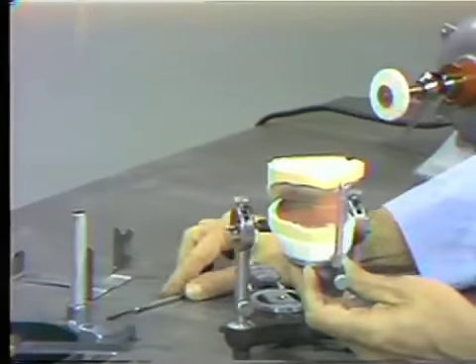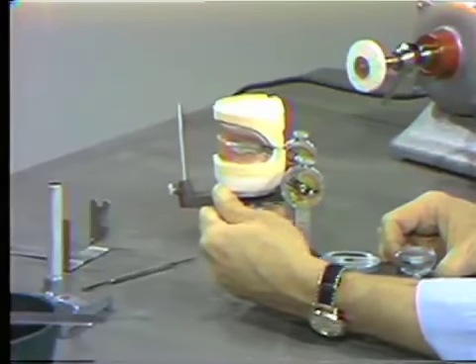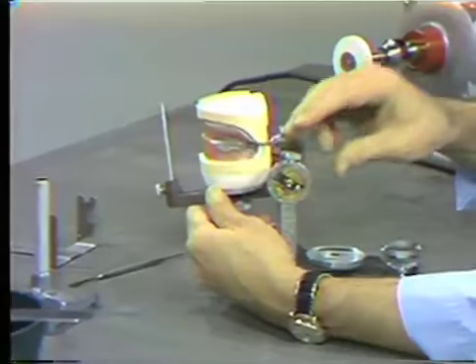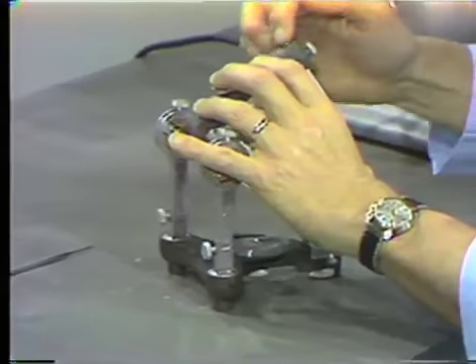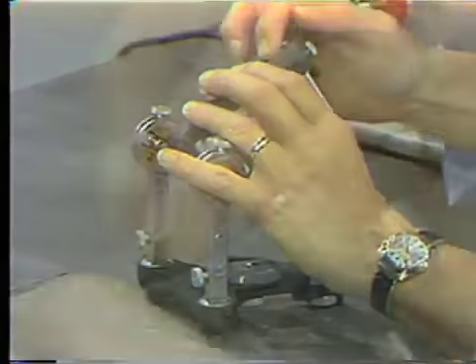Now our next step is to ensure that our articulator is in the correct condition for mounting. This means that the lateral posts of the articulator are both set at 0, and you'll note that the pin, the incisal pin, is flush with the top of the upper member.